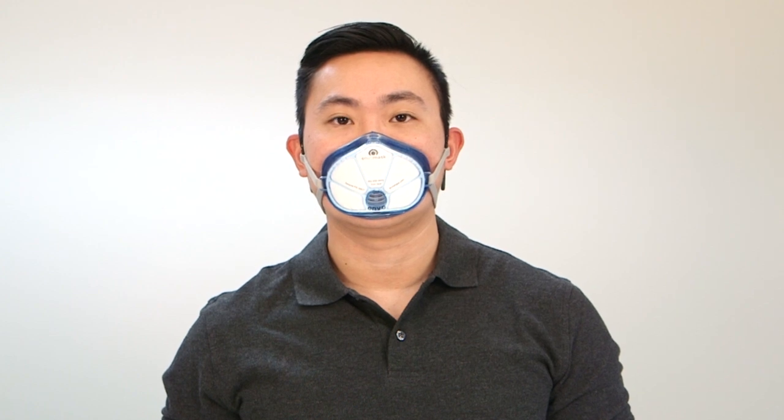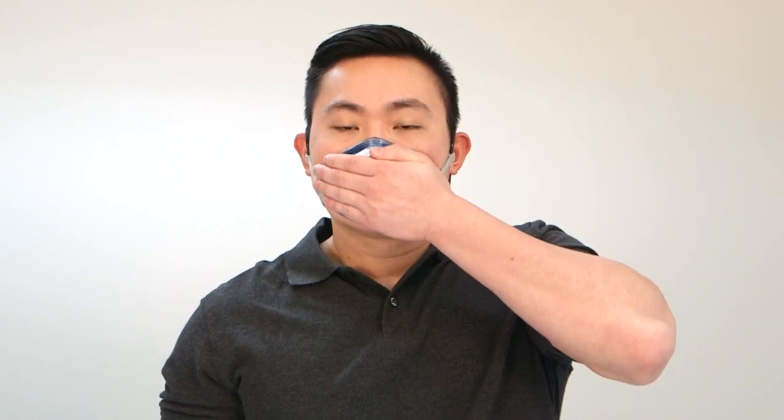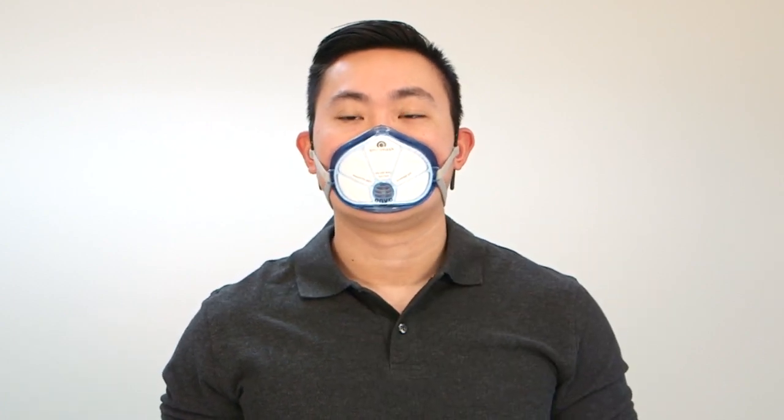If your mask leaks, your goggles may fog and you will let harmful particulate in. Check your mask seal by placing hands over the filter area to block air and inhale. The air gel cushion should compress during inhale. If you cannot feel the air gel pressing into your face, adjust the mask and try again.